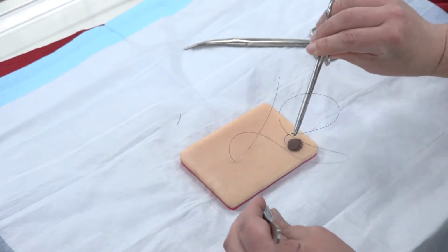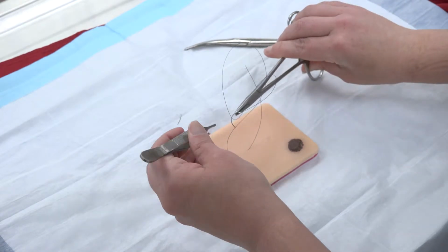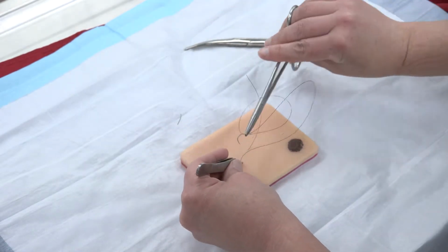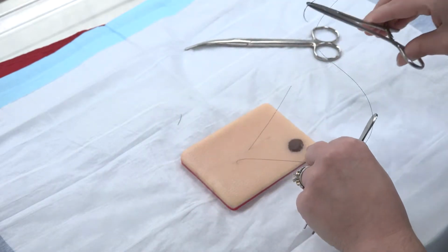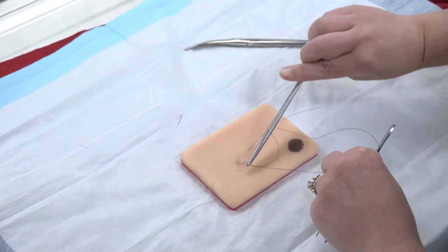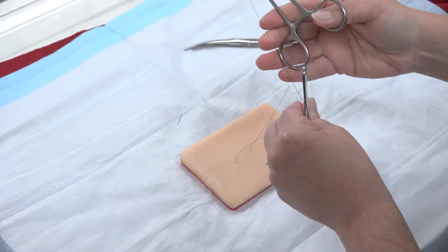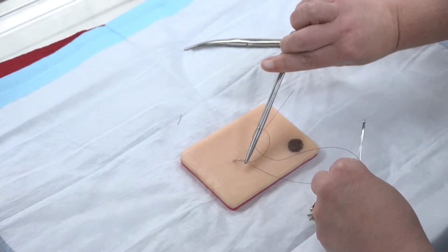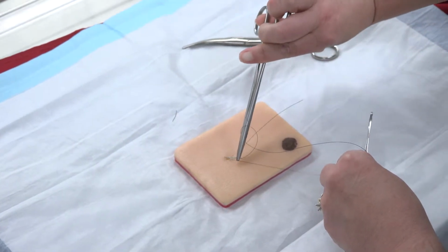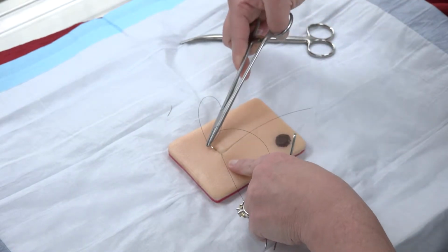So now, because I'm going to go on the other side, I need to rotate so that my needle is pointing that direction, or away from me. And so I'm going to hold my suture with one hand and rotate my needle. And you'll notice I actually took my fingers out a little bit to get a little bit more rotation. That's okay. And I'm going to use my needle as a manipulator and go superficial to deep.